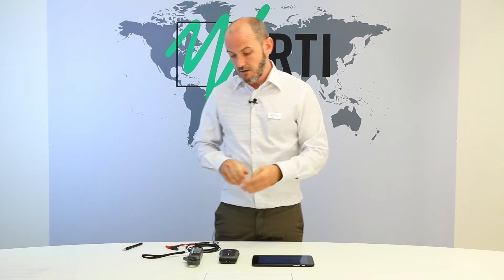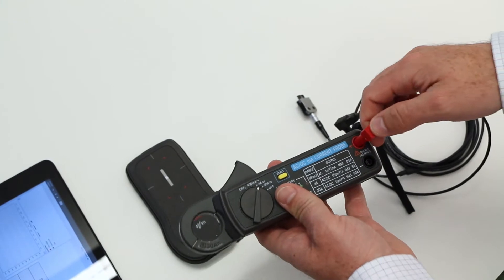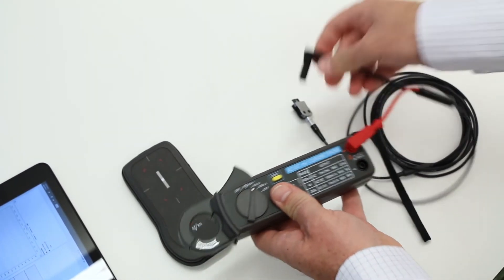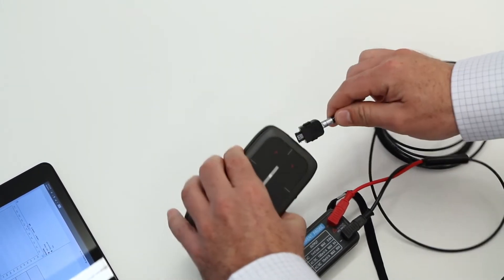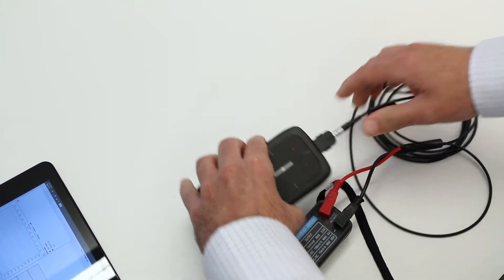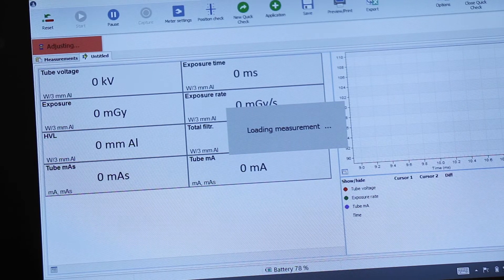Connect the MAS-2 probe to your Piranha. Connect the cables to the output. Connect the cable to the Piranha. Ocean 2014 will suggest new settings for the detectors.